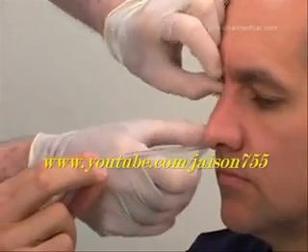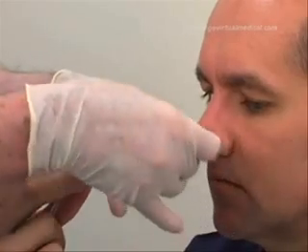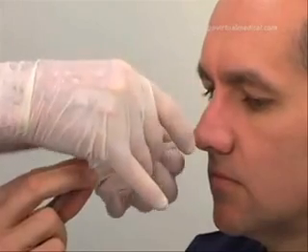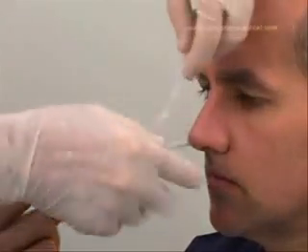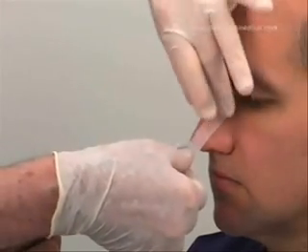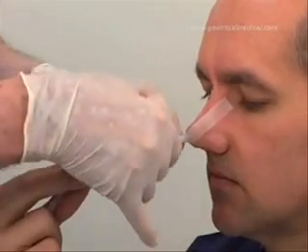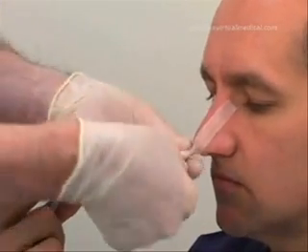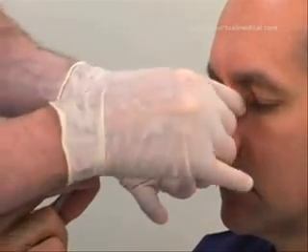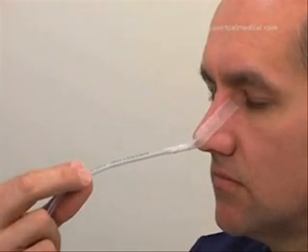Use the Steri-Strips to attach the tube to the nose by applying one end to the nose and wrapping the other end around the tube. Ensure that the tube is not applying excessive pressure against the nostril, as this can lead to necrosis.